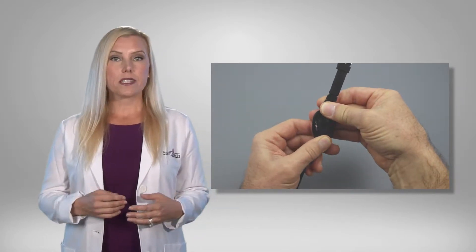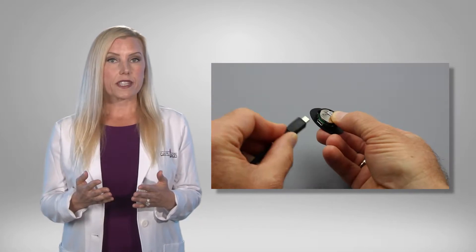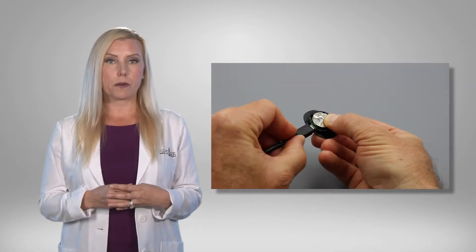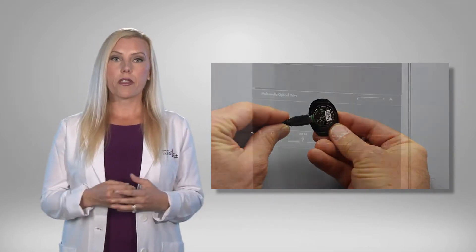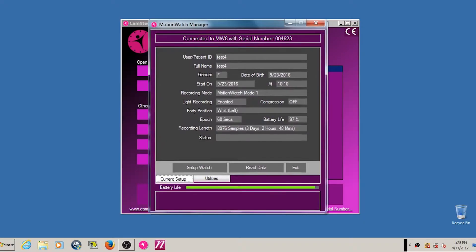Once you have completed a recording on the MotionWatch, you are ready to download the stored data to MotionWare. Remove the watch face and connect the USB cable to the watch and plug the other end into your computer's USB port. This screen will then appear.